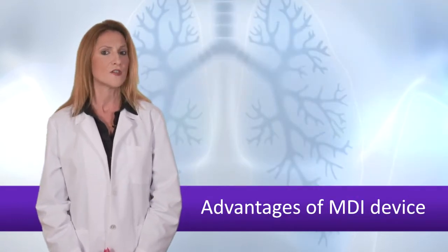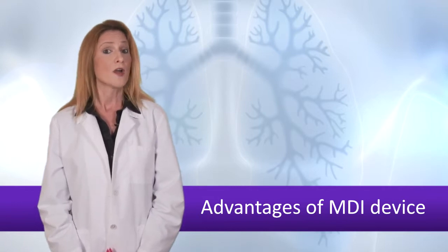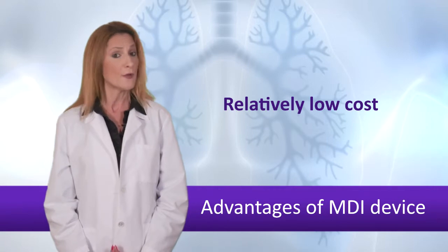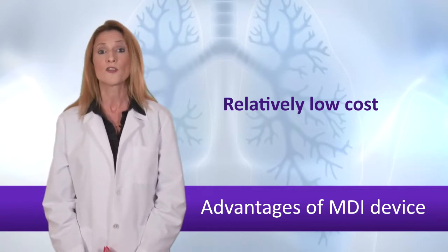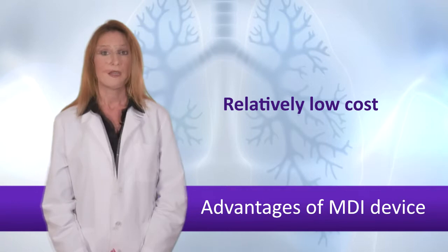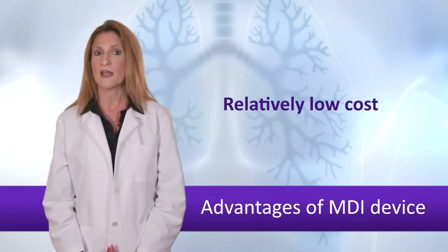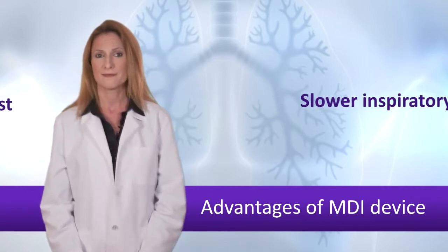There are several advantages to MDIs over other respiratory delivery systems. The cost per dose to deliver drugs tends to be less with MDIs than with either dry powdered inhalers or nebulizers. Some MDIs contain up to 200 doses, which is more than many DPIs, so an MDI may need to be refilled less frequently. Unlike the dry powder inhalers, MDIs may not have a secondary expiration date after initially opening the package, so there may be less drug waste.